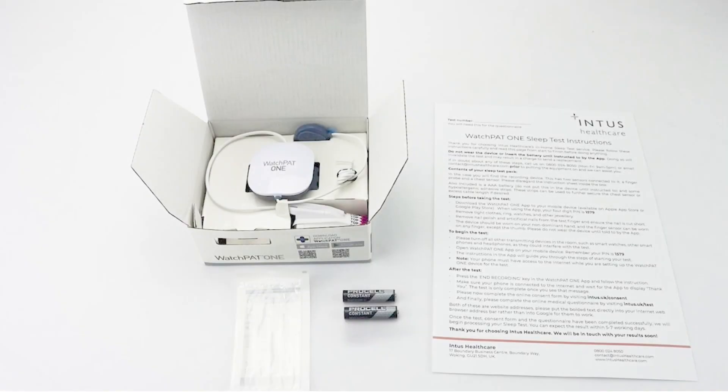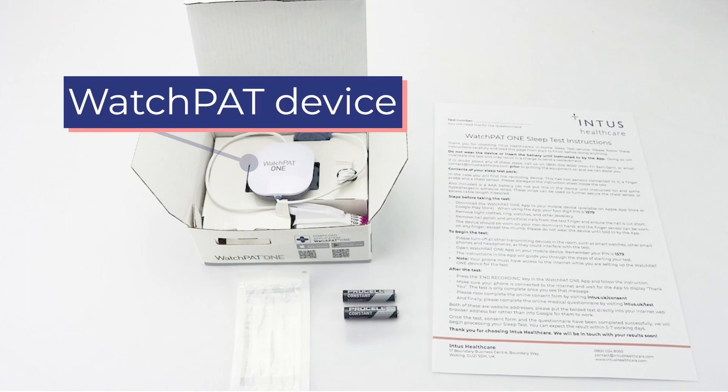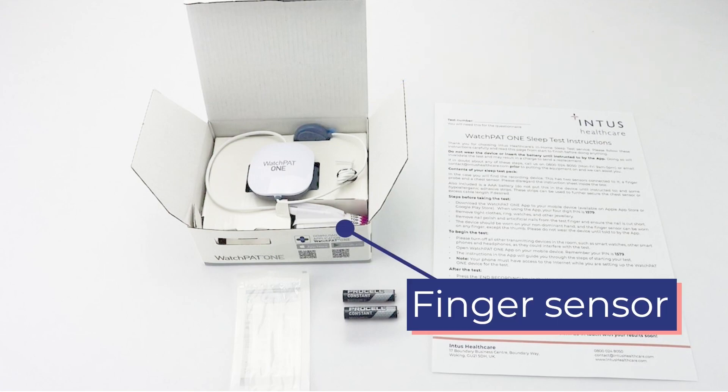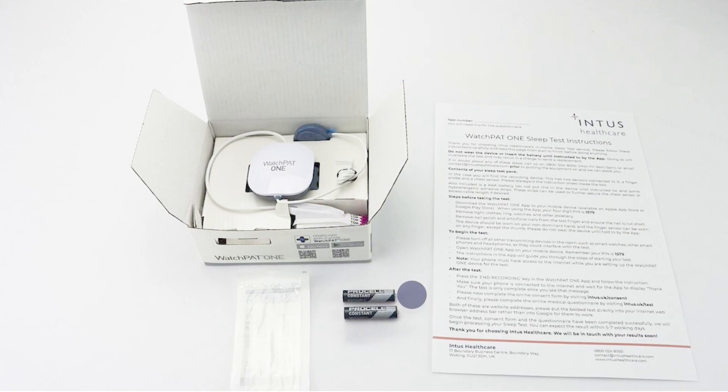When opening your test you will find the following: a set of instructions, the watch pad device, a chest sensor attached to the device, a finger sensor attached to the device, spare AAA batteries, and also some hypoallergenic adhesive strips.